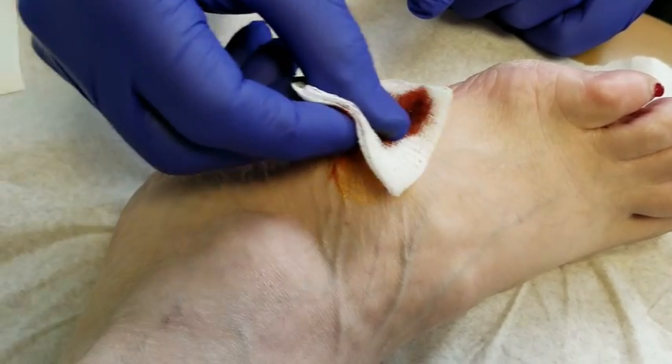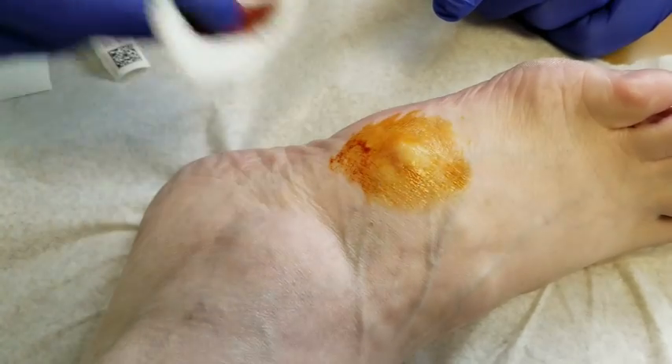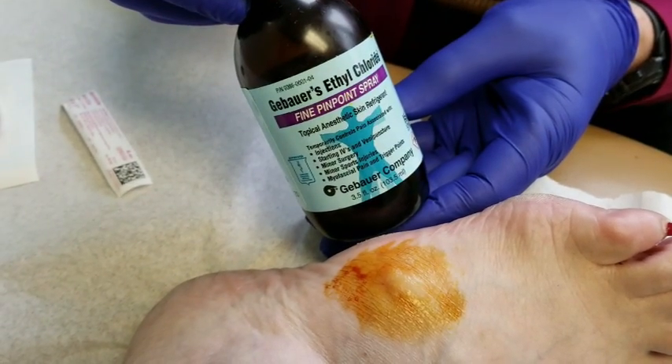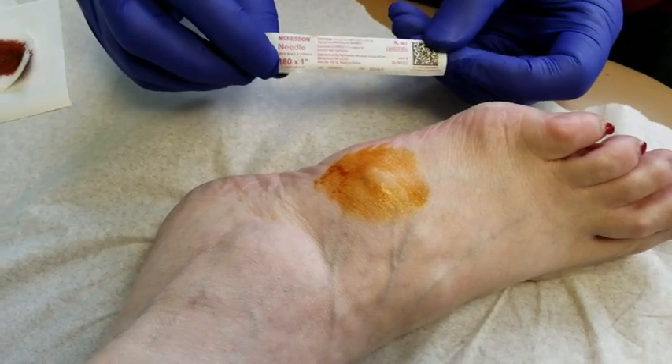I'll take a little betadine on this to sterilize it. Then I'm going to use this ethyl chloride spray to numb the skin, and then I'll use an 18 gauge needle.